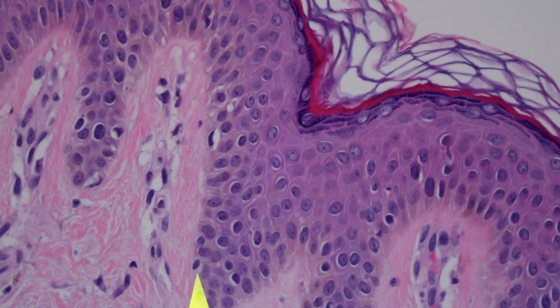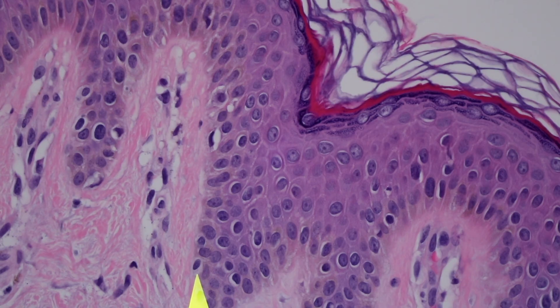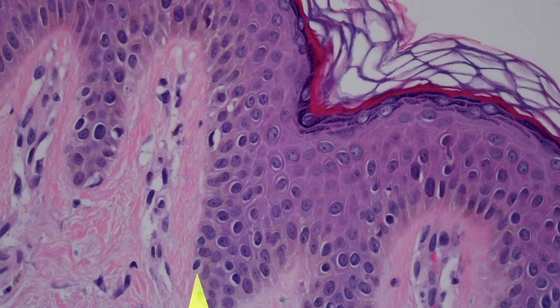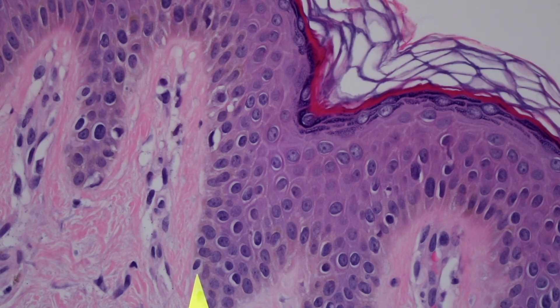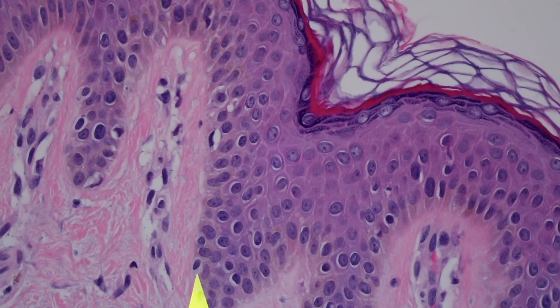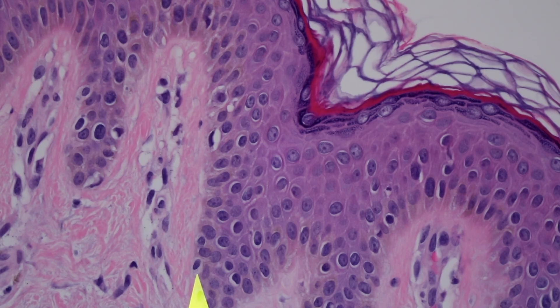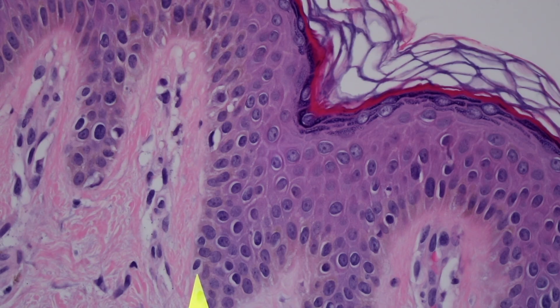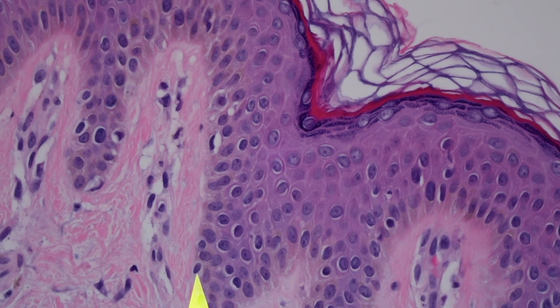But you'd ask: why are the melanocytes gray and not brown? That's because the melanocyte makes melanin pigment and then, instead of keeping it all to itself, it actually shares it with all the keratinocytes around it. It has these little finger-like processes called dendrites, and it sends these little dendrites out to the adjacent keratinocytes. The keratinocytes actually kind of eat the little fingers off those dendritic branches - that's how they ingest the pigment into their cytoplasm.